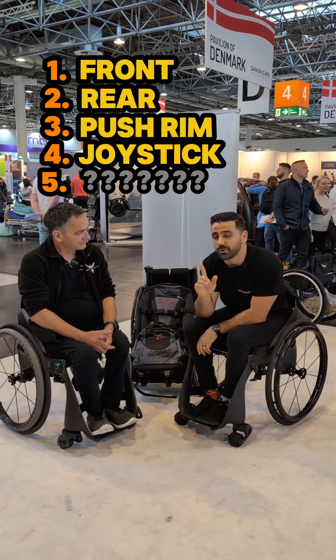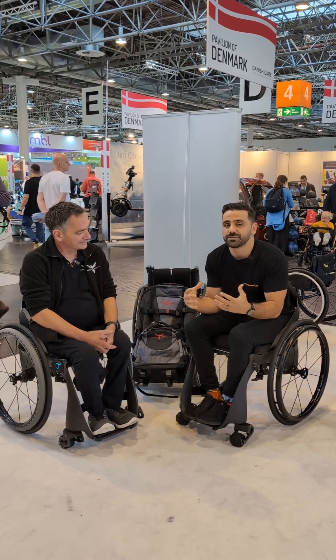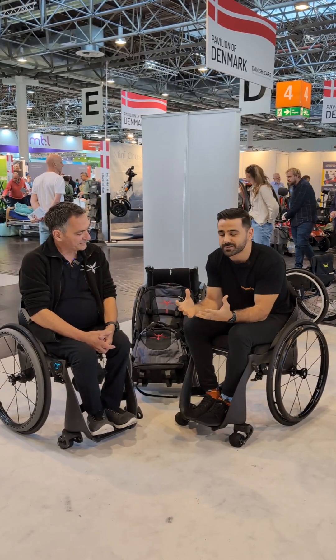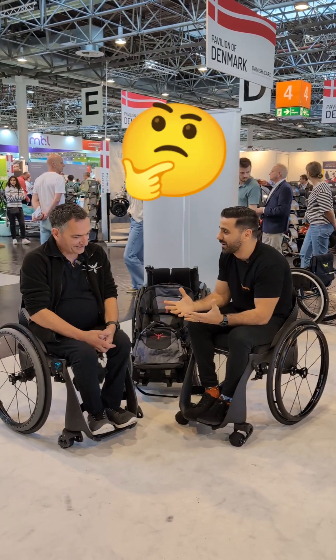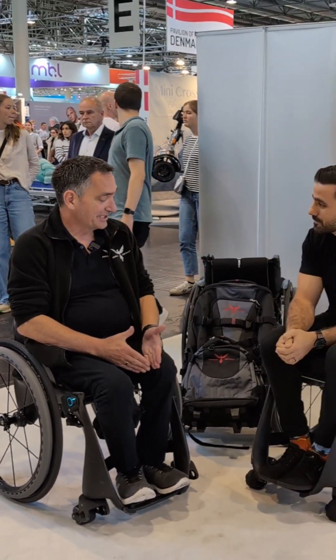But now there's a fifth one. And you don't put it on the chair — it is a part of the chair. In fact, it's a new revolutionary technology to bring into the wheelchair space. What are we talking about? Hybrid. Yes, hybrid is the new thing.